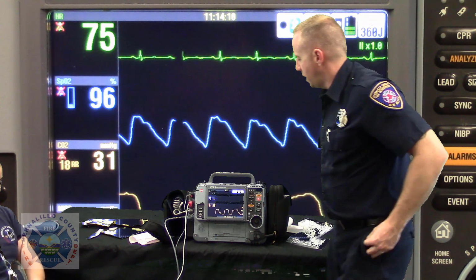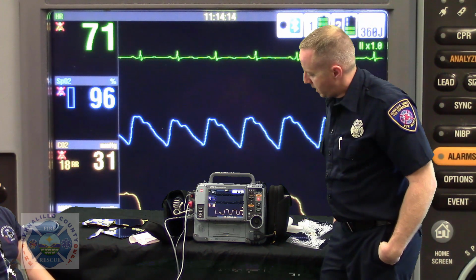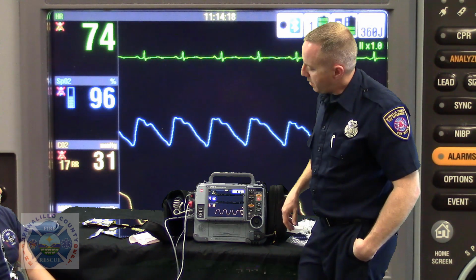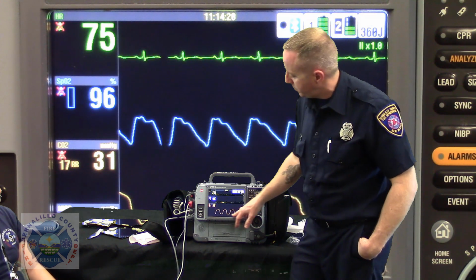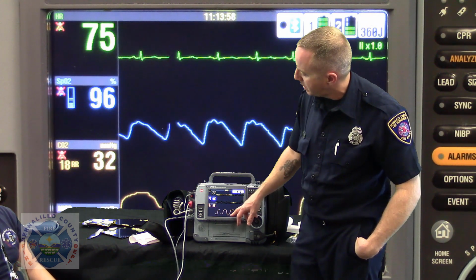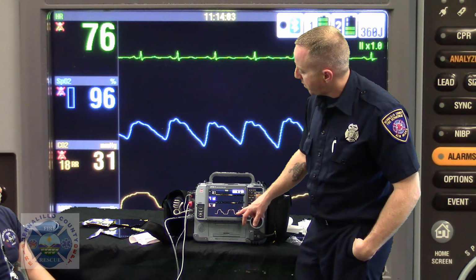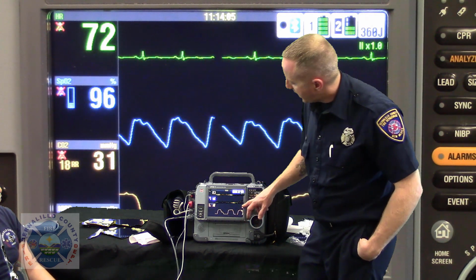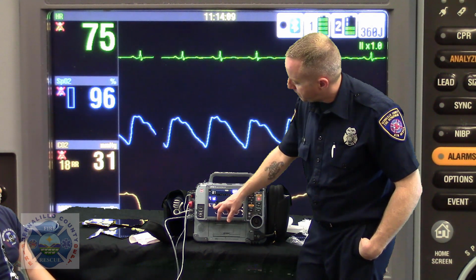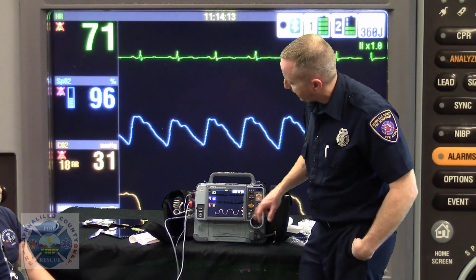We'll let the pulse ox come around and start giving us a pulse heart rate. So now that I've got a good waveform and I'm watching my patient's breathing status, their end tidal CO2 number, their waveform on the capnometry reading here, I see I have a scale of 0 to 50 with an end tidal of 30, so that graph's going up to about where the 30 would be on that scale.